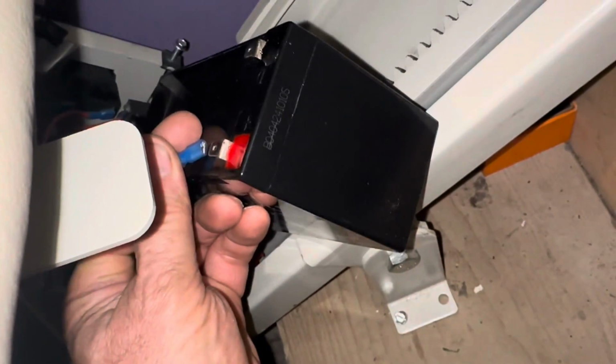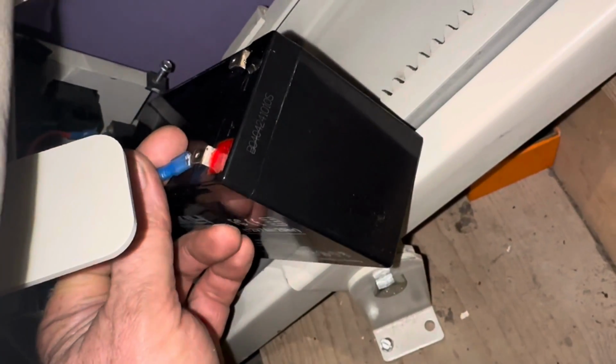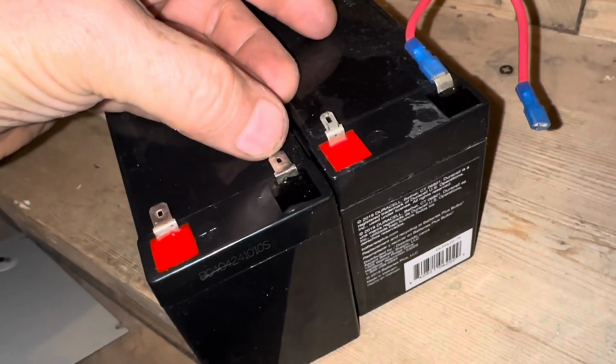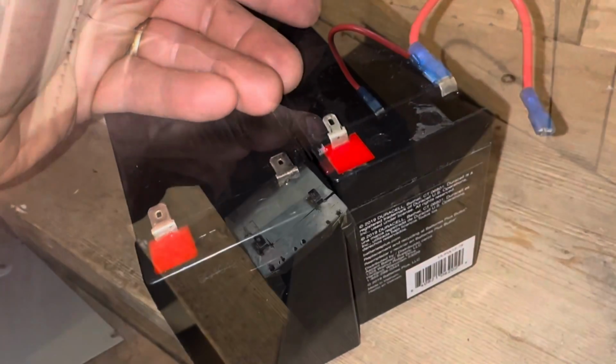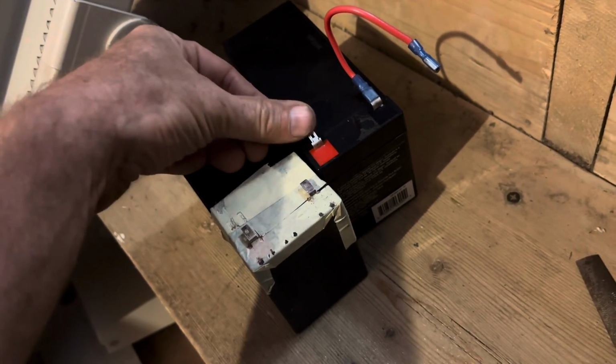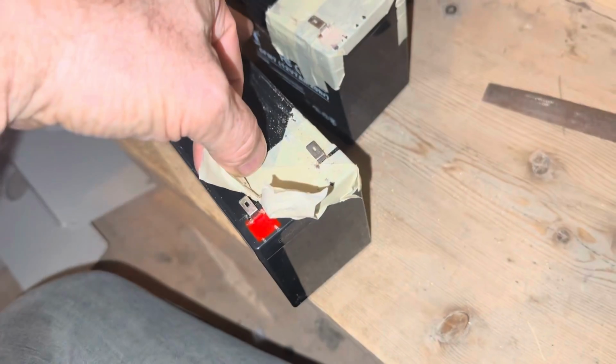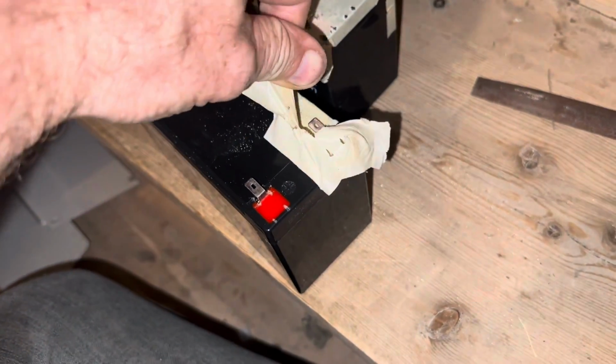The terminal on this is just a little bit big, but the battery size is correct. There's always something. You can see this one's thinner, so we're going to have to file it down or get new batteries. When you're buying new batteries, make sure that you've got the smaller end if you don't want to file them down. With some filing, we've got them down to the correct size.